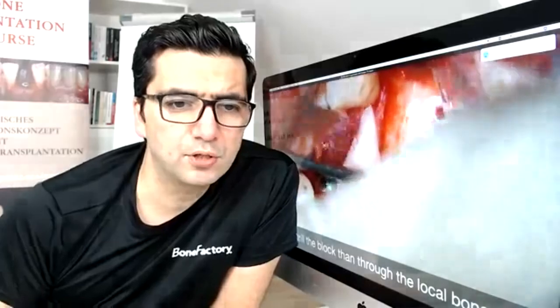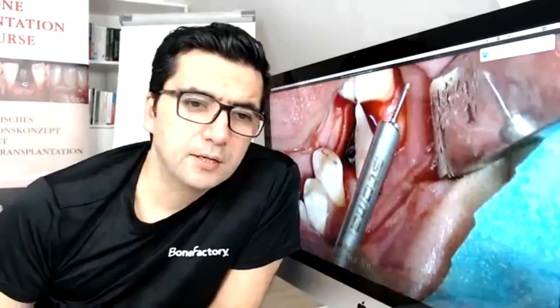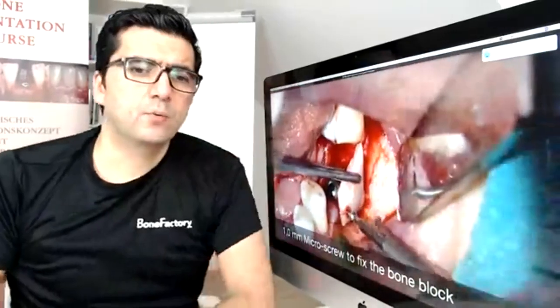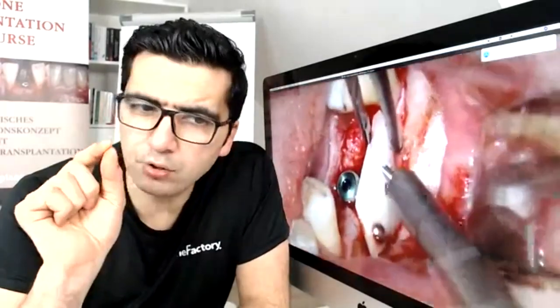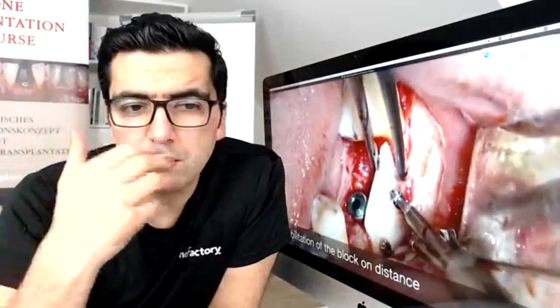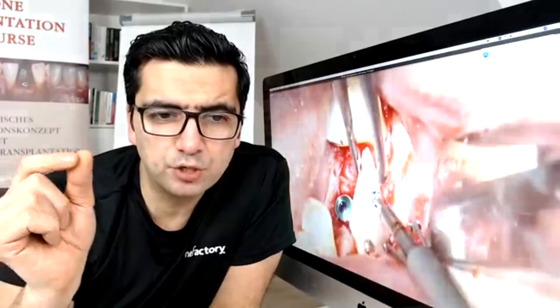You can see a four to six millimeter buccal defect here. When you want a long-term result, we must use vital products. I fix the first block using micro screws — a special 1.0 mm screw which allows me to create small holes, effective in both small and large defects. You can see the special screw holder which catches the head of the screw.